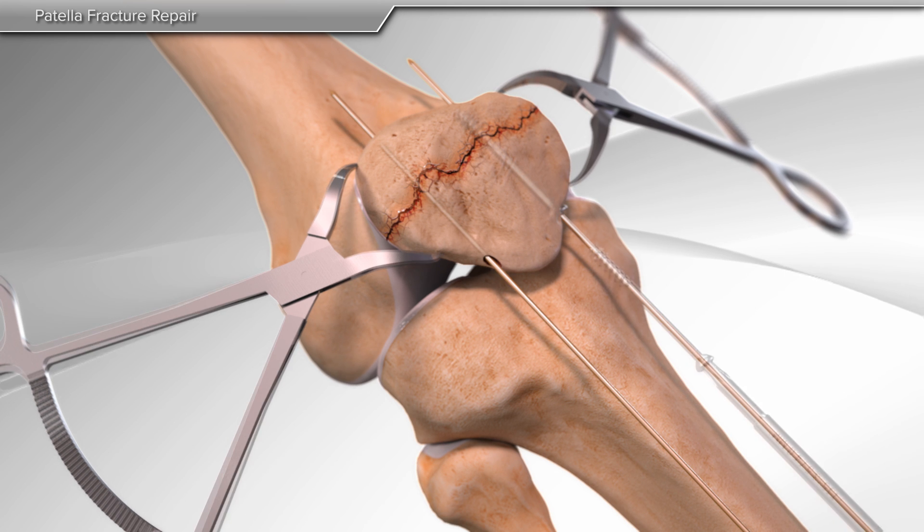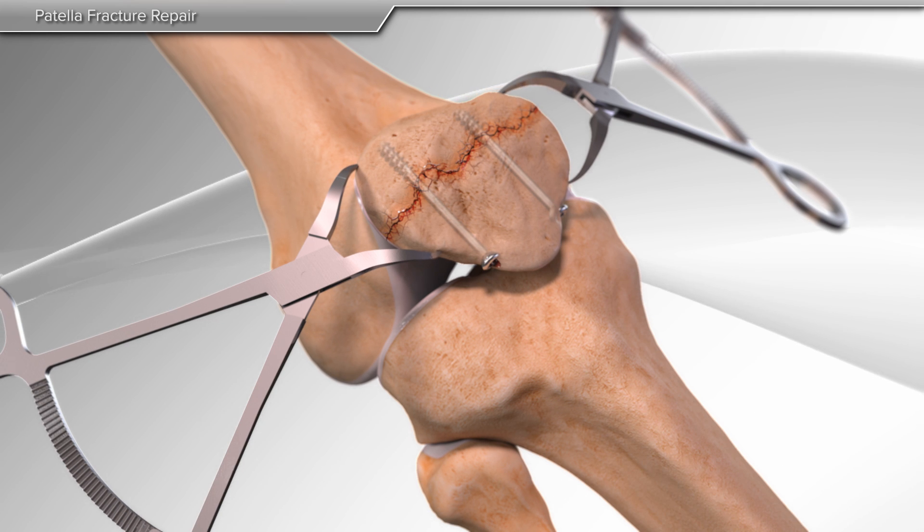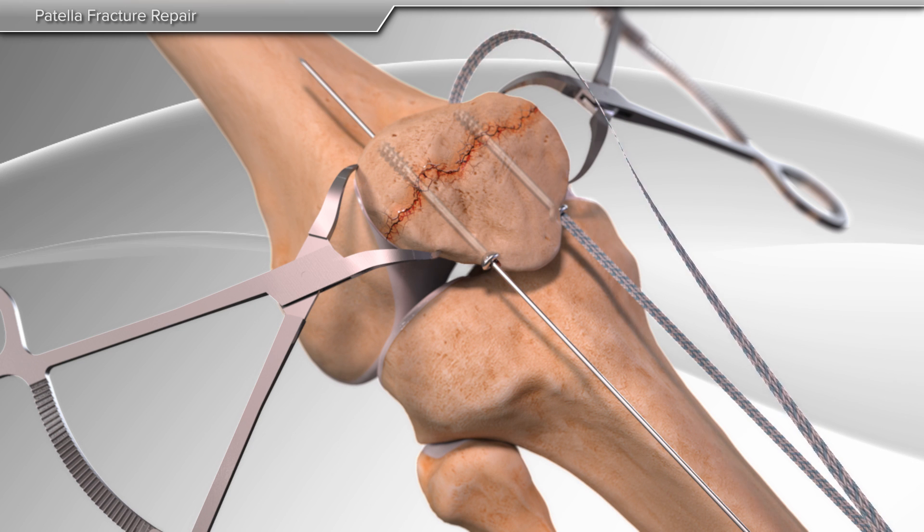After pin insertion, your surgeon prepares the bones for screw insertion. Once the screws are placed and the fracture is secured, a specific high-strength suture is passed through the screws.